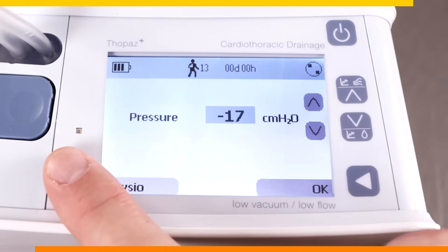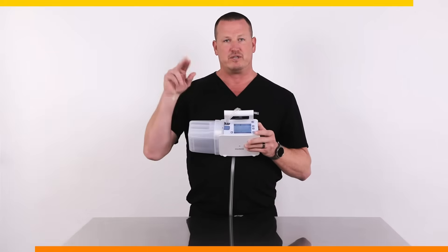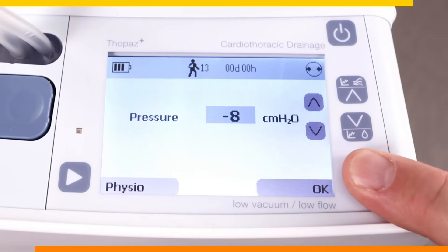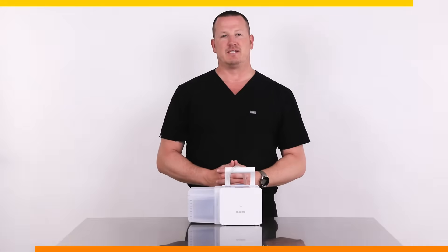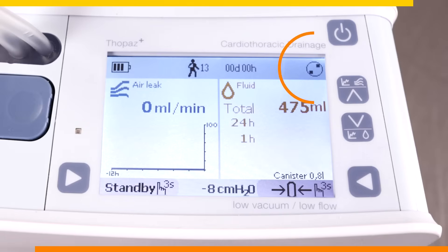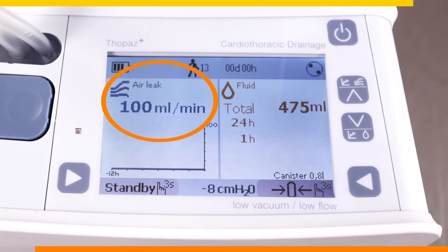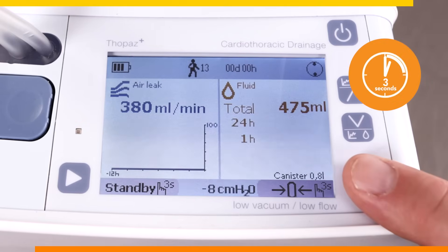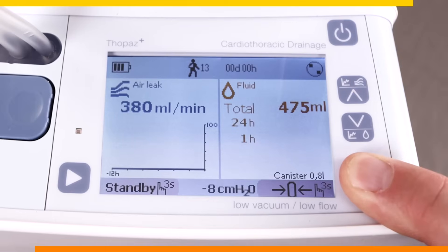You can also access Physio Mode for the water seal setting on the bottom left of the screen. After making your adjustment, select the OK option on the bottom right to accept the changes. To know if therapy is active, in the top right-hand corner of the display there is a wheel that is rotating. The screen is split into two areas: on the left shows the air leak in milliliters per minute, completely different than counting bubbles, and on the right is the fluid drainage from the patient. The device is defaulted to show the total drainage, 24-hour drainage, and 1-hour drainage. You can activate or reset the demand fluid counter by pressing and holding the bottom right arrow for three seconds. This will not affect the other fluid values on the screen.